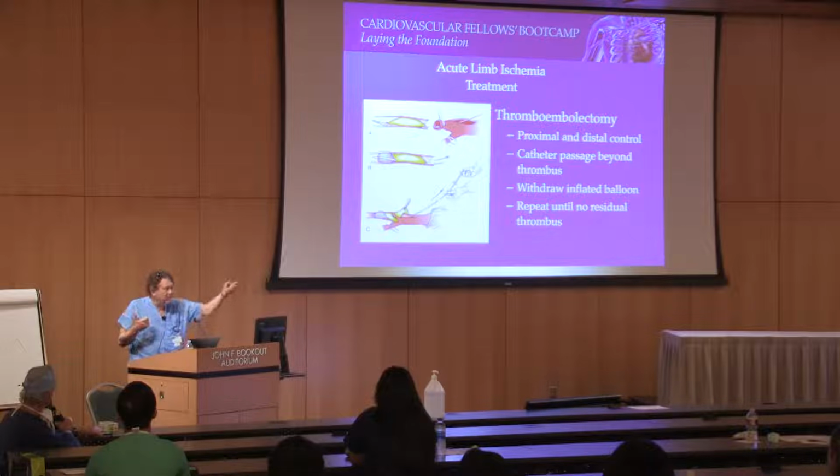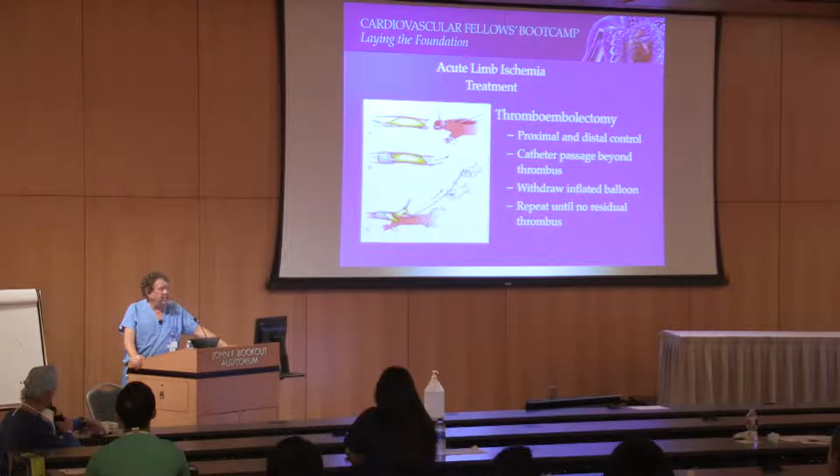Syringe up here, blows up there. Oh, that's a great idea. Much kind of like the DeBakey who said, we went to the IRB was me. I said yes, so we went ahead and did it. And that was the whole genesis for the development basically of a Fogarty catheter. And it is something you will use 3 or 4 times a week, particularly if you're doing dialysis access. This is one of the main ways in which clot is actually being removed from devices, I should say.